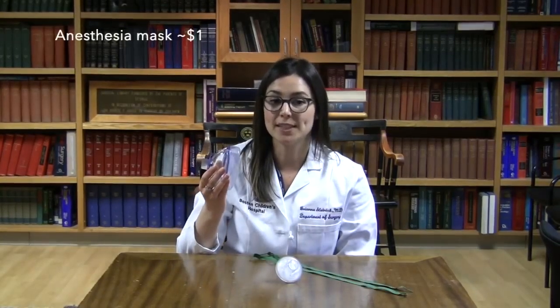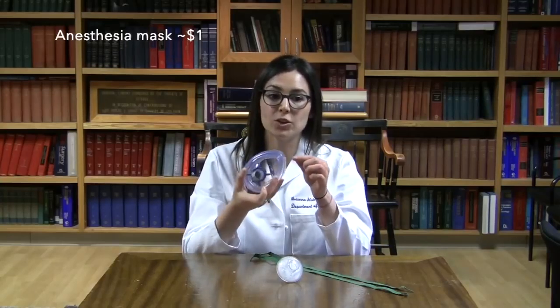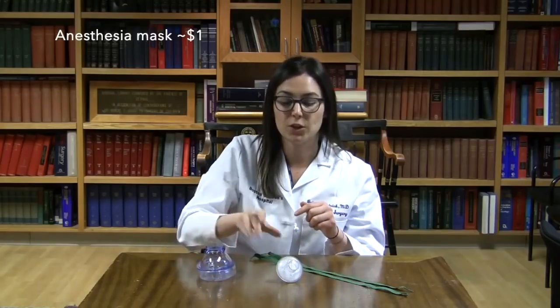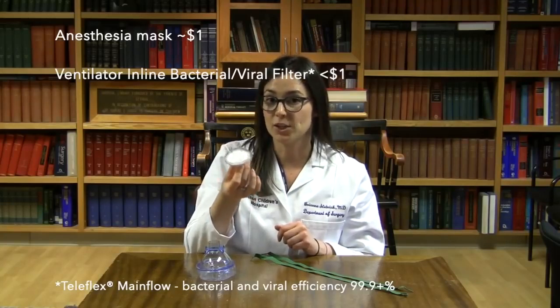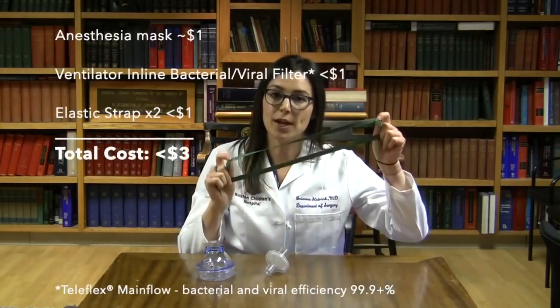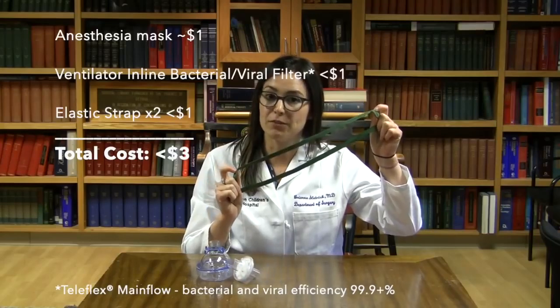The items you will need include an anesthesia face mask, preferably one that has a hook ring on it and also one that has a valve to inflate and deflate the cushion. You will also need a ventilator inline bacterial and viral filter. For this demonstration, we're using the Teleflex main flow bacterial viral filter. However, there are many others that exist that you may have at your hospital. Lastly, we're using two elastic straps that we removed from a nebulizer mask. You can use any elastic straps that you can find.